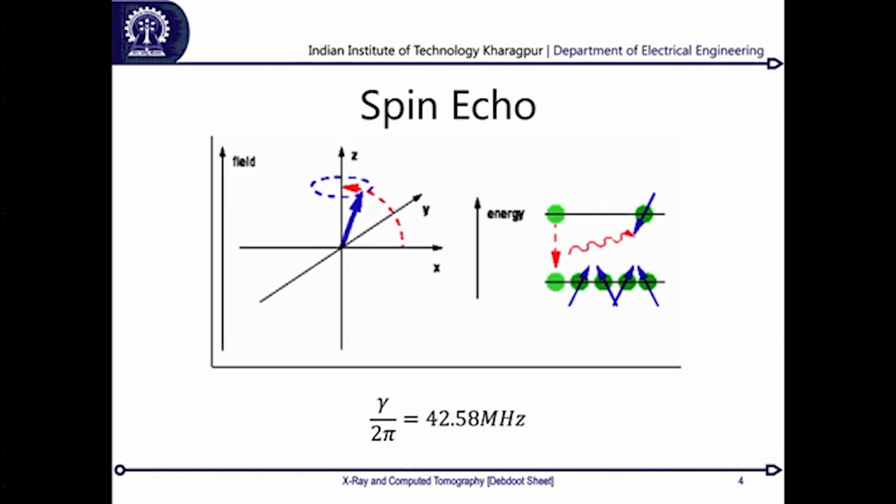Whenever we come to a different concept called RF coils, we will come into that, what comes in terms of a radio frequency over there. So as of now, remember that we are going to give certain energy, and this energy is going to be in the form of an electromagnetic pulse, where the electromagnetic pulse has the same frequency as the Larmor frequency of the atoms which we want to excite. And this is why we say that all of this MRI imaging which we are going to do is dependent only on hydrogen atoms, because we are going to stick to frequencies specific to hydrogen atoms itself.